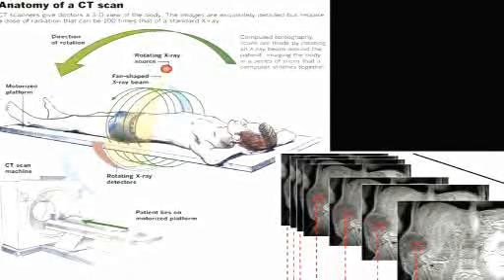Now, what if we wanted more functional techniques? This CT scan tells us a lot about the anatomy, the specific topography or geography of a tumor and the patient's insides. Now we need to interrogate the tumor itself and look at some of its functionality. What kind of material is it secreting? What's it taking up on its cell surface? In neuroendocrine tumors, nuclear medicine has some very elegant tools to look at that.